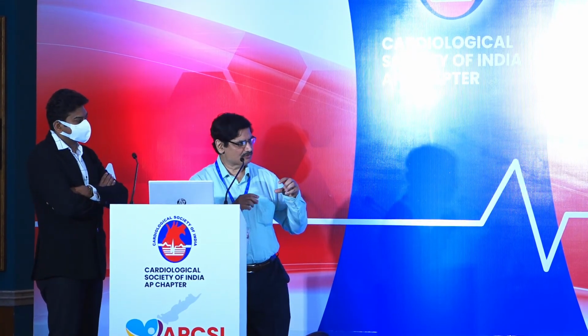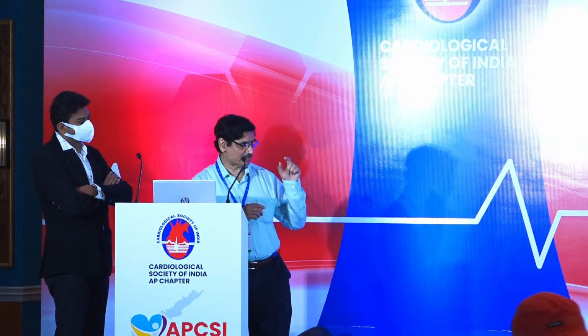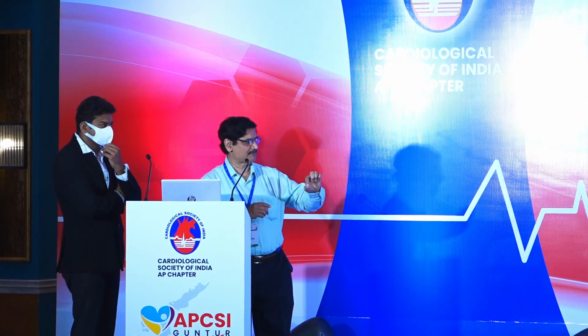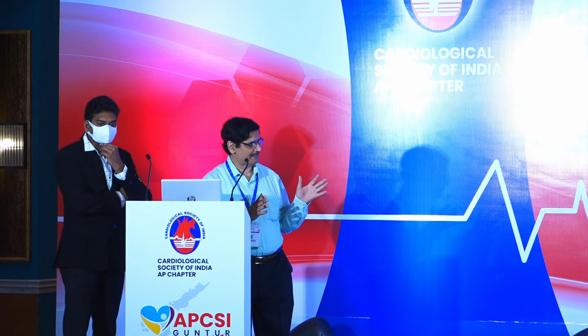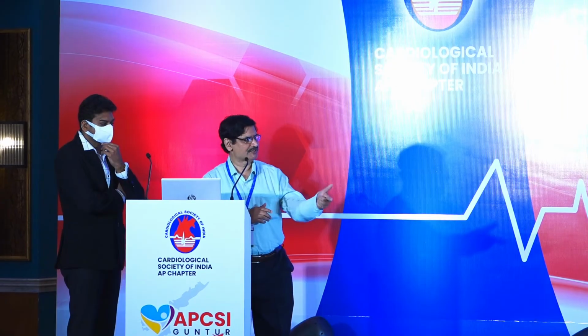I want to answer Dr. Simon regarding your question. Most important, as Dr. Radhikant told, healthy is okay. But in diffuse disease, whenever you are landing, what he told is correct, but only if you see a vulnerable plaque. Whenever you are landing, if there is a vulnerable plaque, don't land in that one, even though there is 50% plaque and 50% normal. If it is fibrous plaque, yes, you can land. Vulnerable plaque, don't land there. Again, it may produce an acute condition itself.